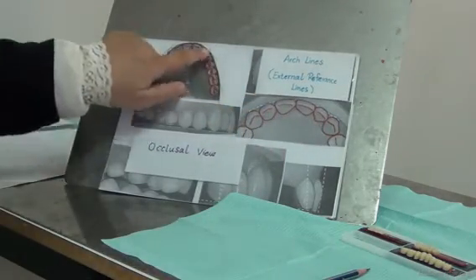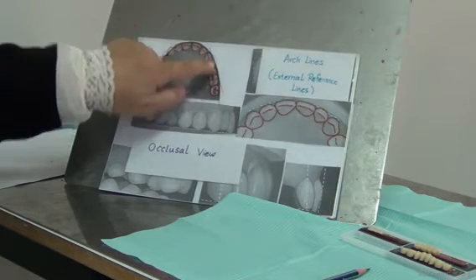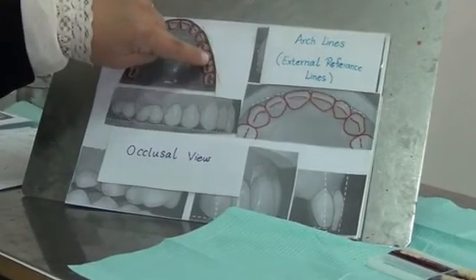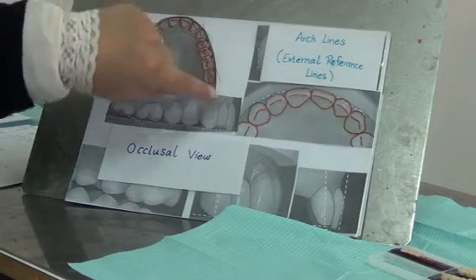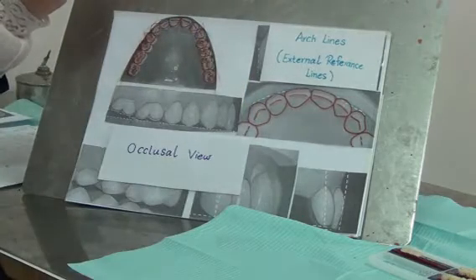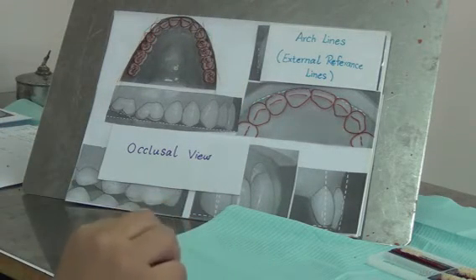The second line is the midline, canine, premolar, and molar all on one line. We call this the mid-buccal line. We call the final line the posterior buccal line. It joins the mesial and distal of molar cusps in one line. So while we're setting the teeth, we take the teeth inwards slightly. We have the central lines later.